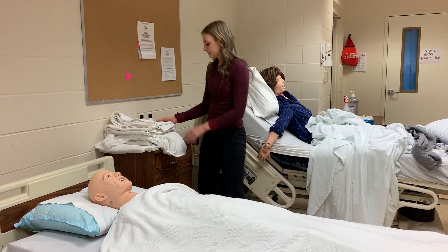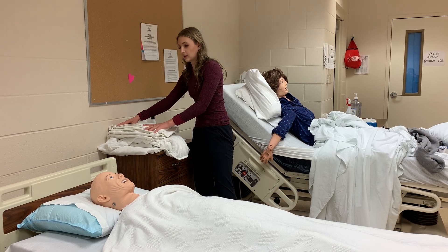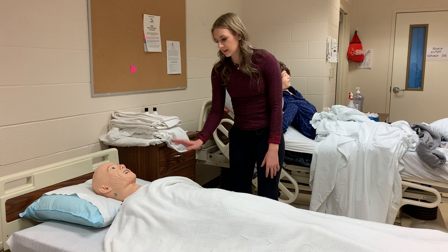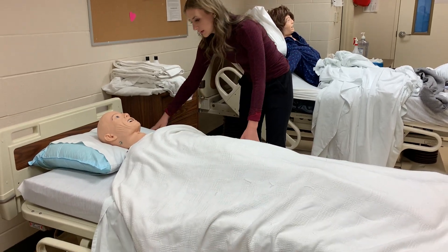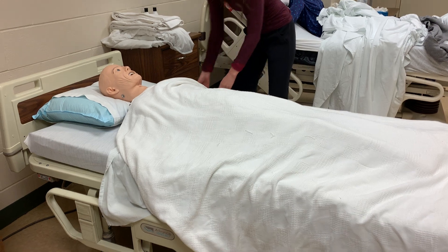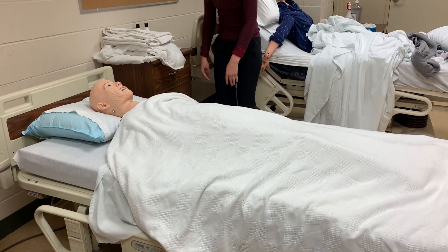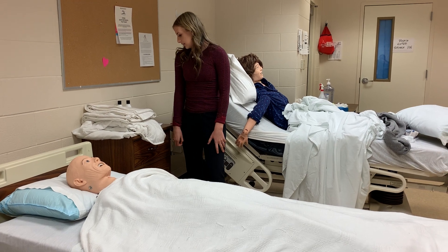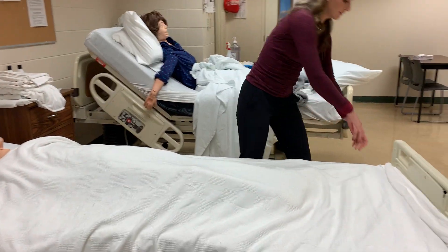Then I would identify the patient I'm working with to make sure it's correct. I would make sure my linens are placed on a clean surface, then lower the headrest of the bed completely, make sure the bed's at a workable height, and lower the side railing.